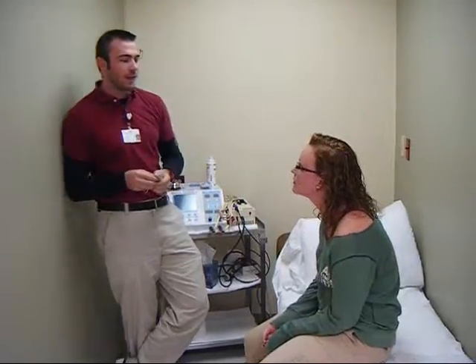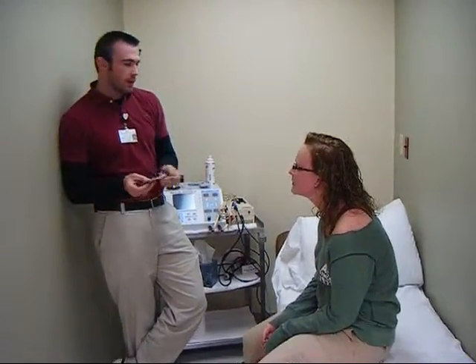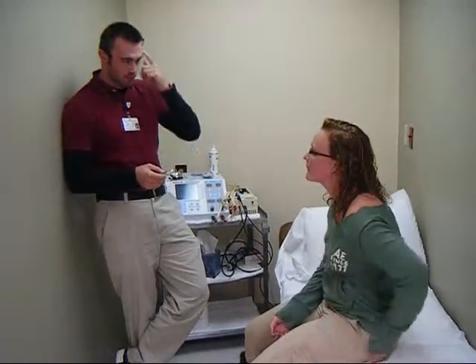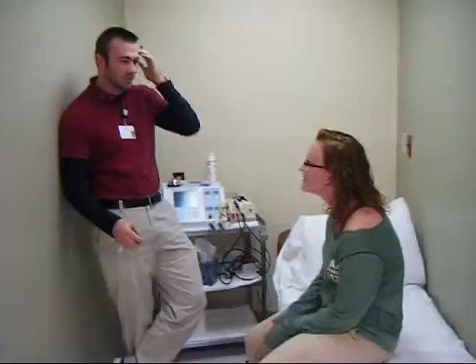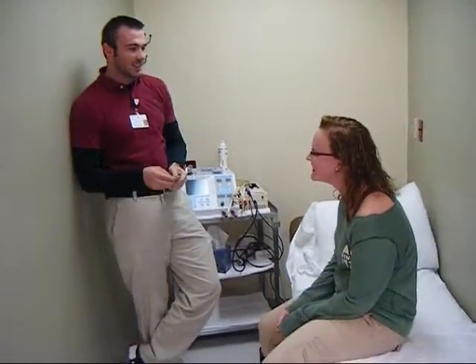Basically the way this works is it sends out electrical impulses. You're going to kind of feel like ants are crawling on your skin. The way it works is you have pain receptors which get sent up to your brain telling you ouch, that hurts. So what this does is it takes the place of the pain receptors — it kind of sits on the bus before the pain can sit on the bus. And it says, nope, seat's taken, can't sit here. So it blocks the pain from getting sent up to your brain.